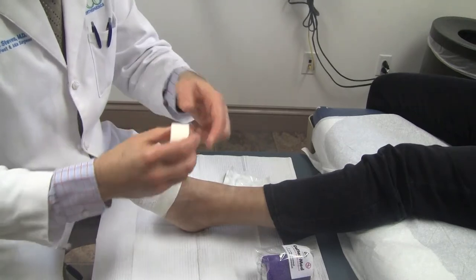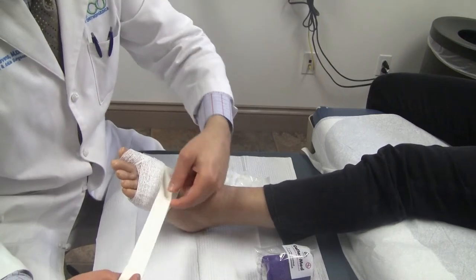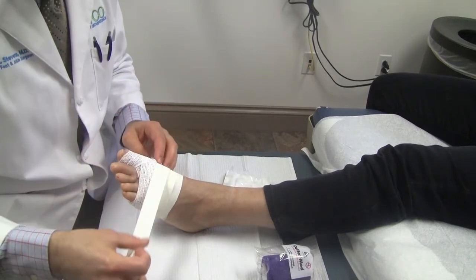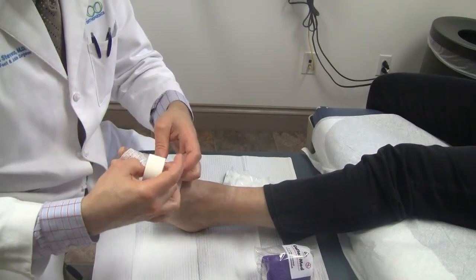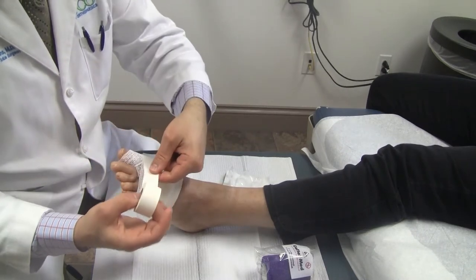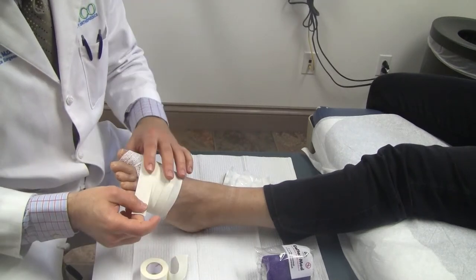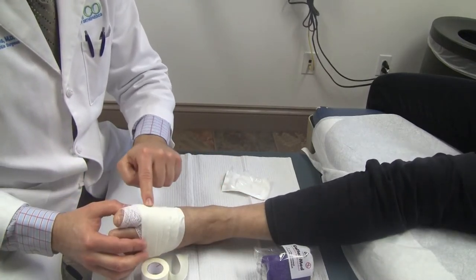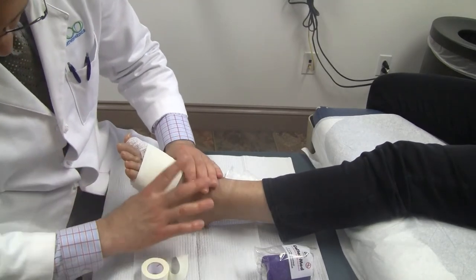When you wrap the foot, it's important to grasp the tape and pull so that you don't over-tighten it on the patient's foot and cut off the blood supply. As you're working your way down, overlap the tape each time by about 50% — that'll give you a nice contour to the foot. We're not trying to lay this on tight at all; I'm putting the pressure on my fingers when I pull so there's no pressure on the foot. When you get to the end of the foot, rip the tape off and use your fingers to smooth it down so it matches the contour of the foot. Notice how that makes the tape wrinkle up a little bit — that's okay. We just want it to match the shape and contour of the foot.